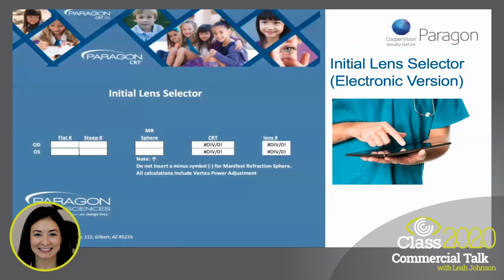So let's take a quicker look at how, once you have the lens calculator downloaded, you'll want to input the patient's flat and steep Ks along with their manifest refraction sphere. The calculator is for myopia, so you don't need to put a minus as it's already calculating for the myopic refractive error. As you can see, once you put in the flat and steep Ks, the parameters for the CRT lens will populate.